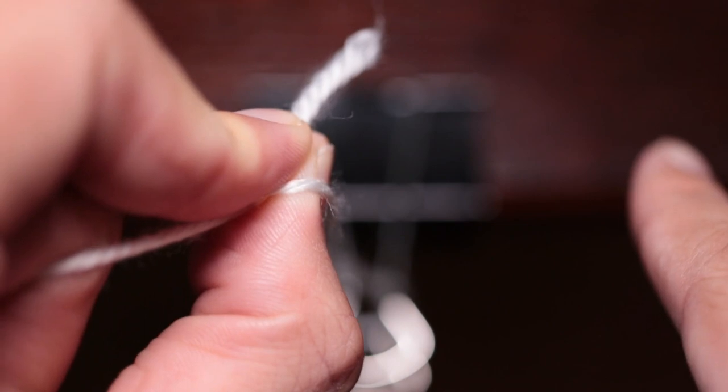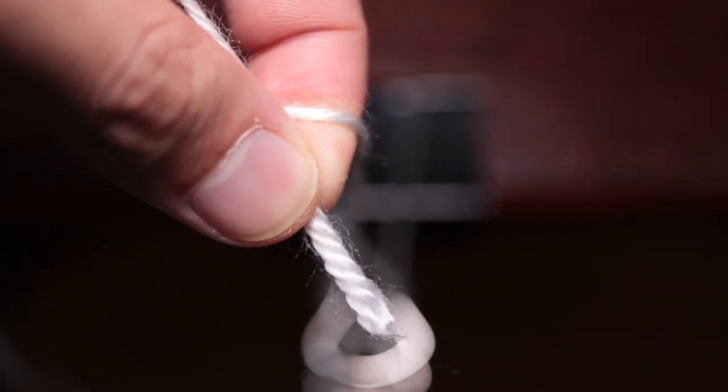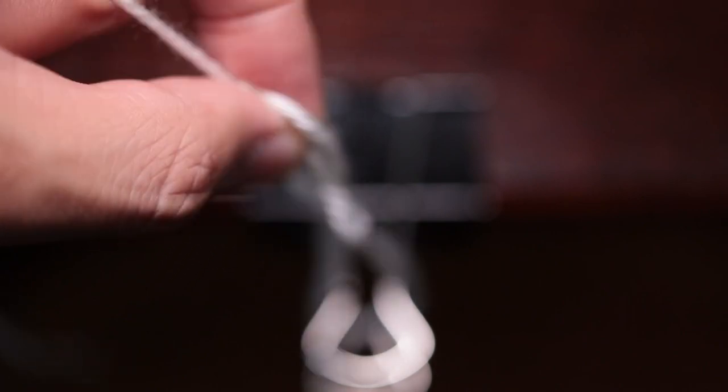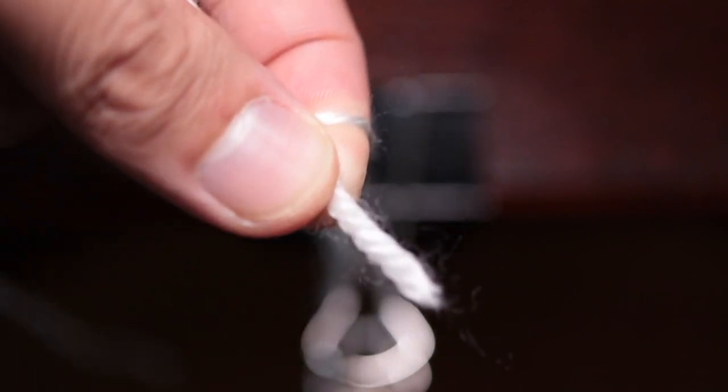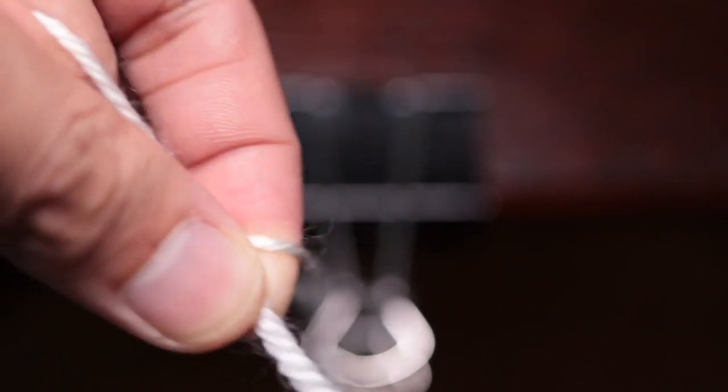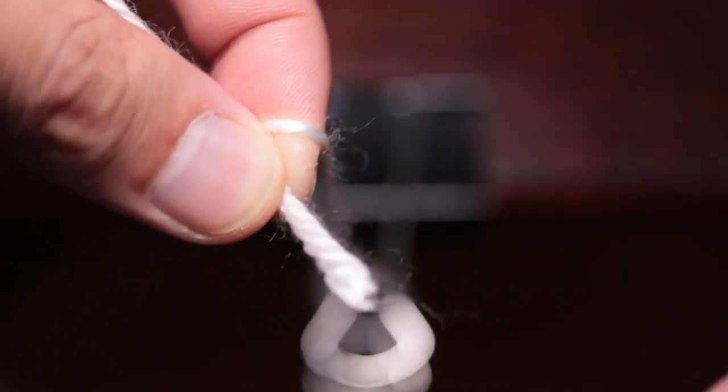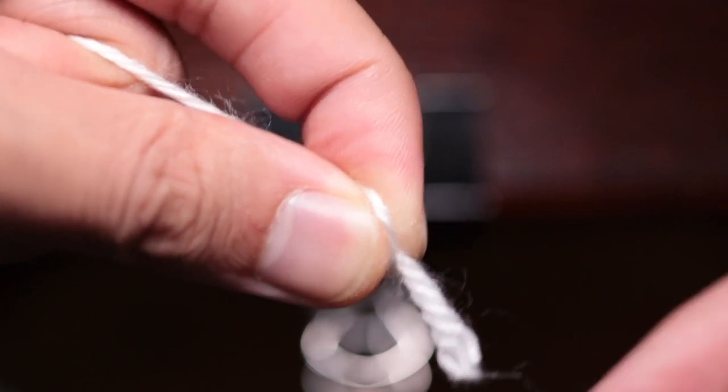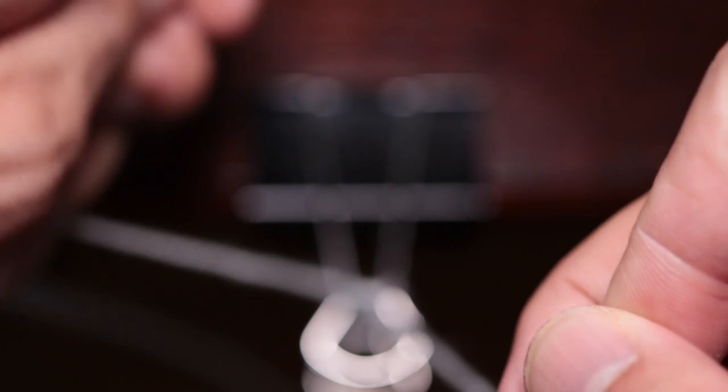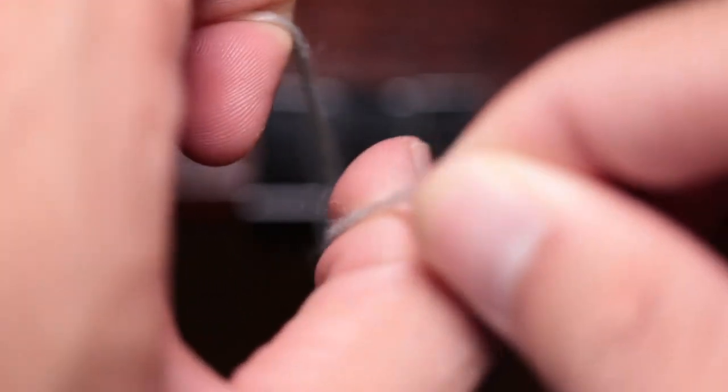This is not what you want—what's commonly taught is to just flip it and do a 180—but you want to make a semicircle so that it goes under and back in the same direction it's facing. The string is facing me, and I'm putting it under and making it face me again as it passes under the string. This helps you know which way to pull consistently without thinking an extra step.